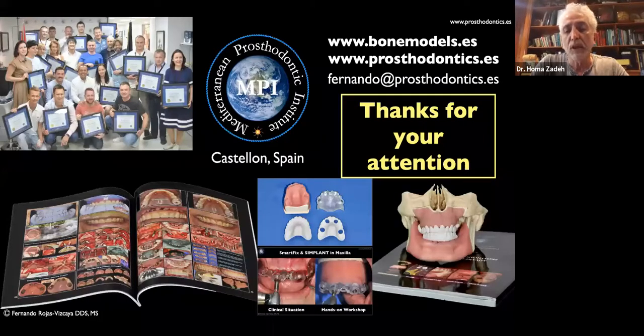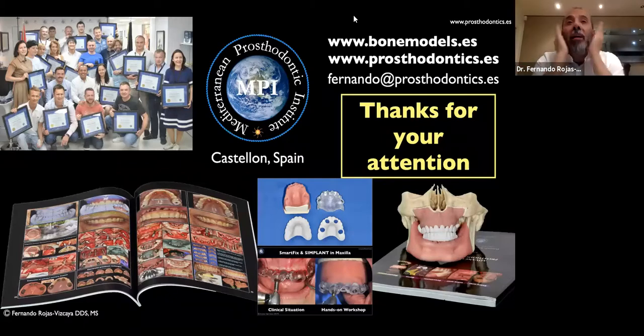Because many times in those cases that you manage, I find that even though this is just about restoring with the white aesthetic, the lab ends up adding some pink ceramic just to strengthen that. And that creates a lot of negative contour on the intaglio of the restoration. Of course, yes, this is an advanced topic, the design of the prosthesis, because many technicians want to make a beautiful prosthesis from outside, but who will clean the prosthesis? And it's important to think about that because this is our business also.